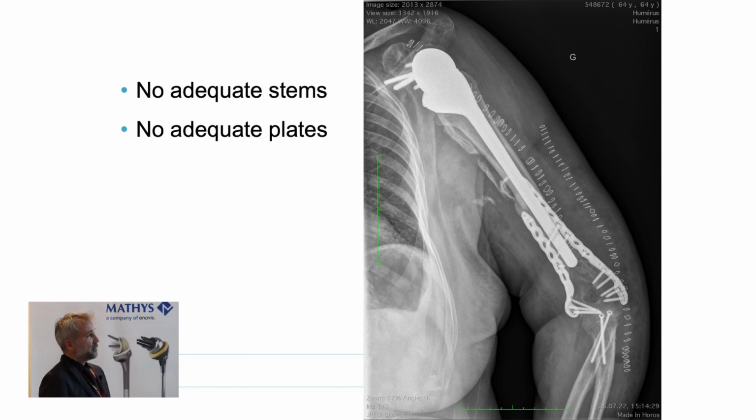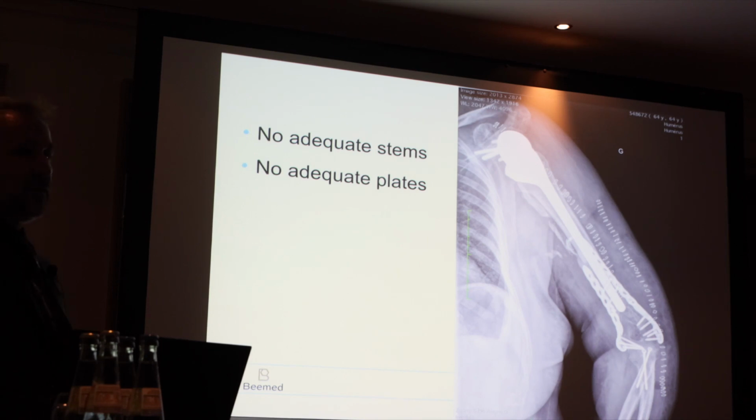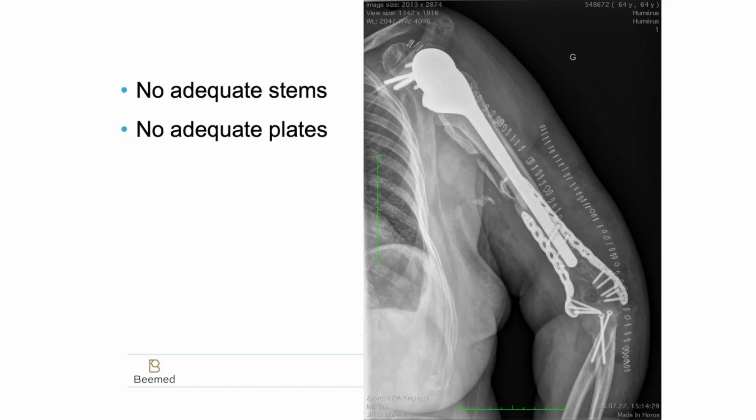So I decided to use a long monoblock revision stem, and I really wanted this stem because it is the only one that I know that has a distal locking solution, and these two screws had to help me to solve the problem. However, this is not a good design because this stem is too short. It's clearly too short. We don't have a long stem.